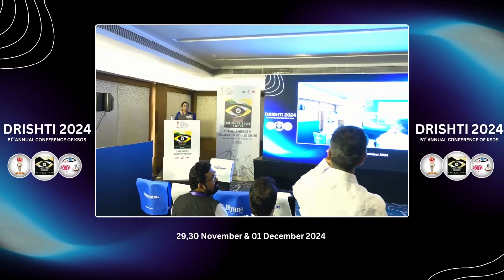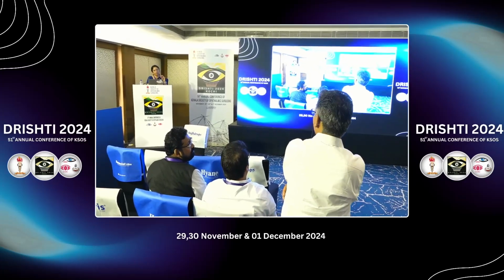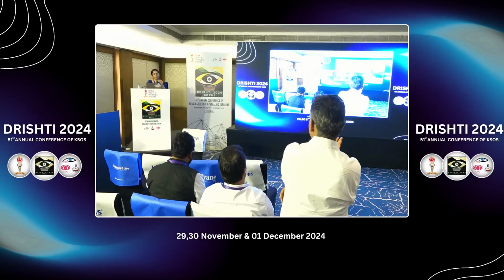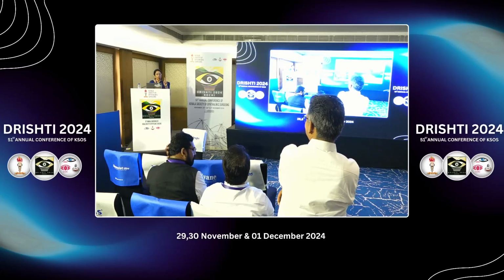One small question. In a lot of patients, the VR surgeon tends to keep the oil because they have a long-standing RD. So you have to make the necessary calculation. Yes. Actually, in these cases, we have the silicone oil mode. Newer optical biometers also have the silicone oil mode. You can just calculate with that mode for these patients.